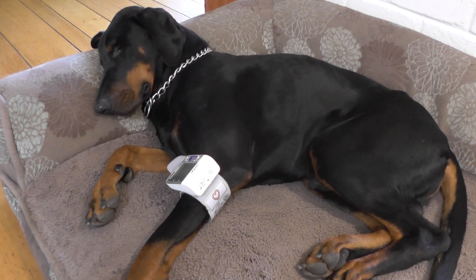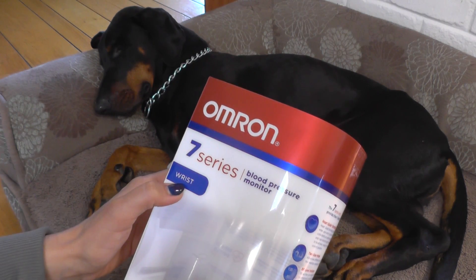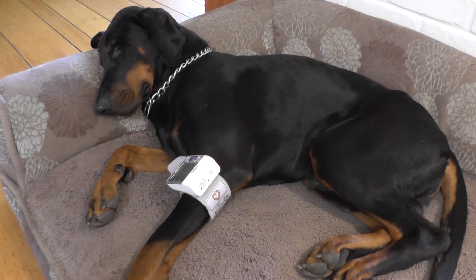To control blood pressure in dogs at home, I use the Omron Series 7 wrist monitor. The wrist monitor fits on a large dog's leg, while cuff monitors are too large. The cost of this monitor is about $50, which is about the same as the cost of one test at a vet clinic.